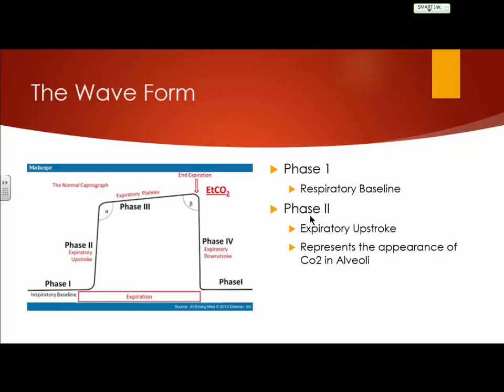Okay, so baseline, we're breathing in. This is where you start. Phase 2 is where you start seeing the appearance of CO2. This is where you would expect CO2, right? You want CO2 to show as soon as you start exhaling.